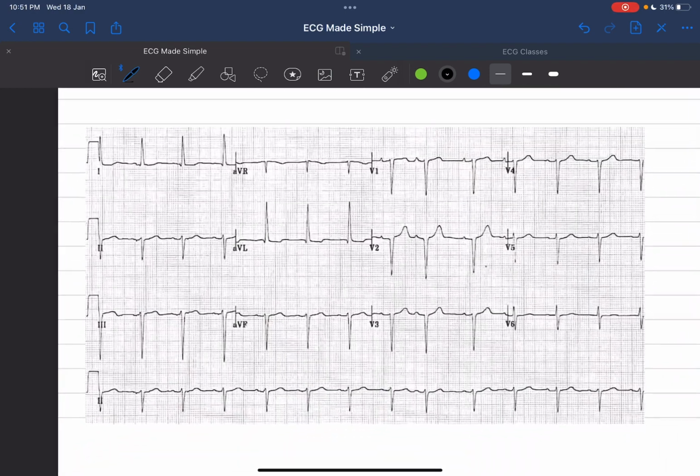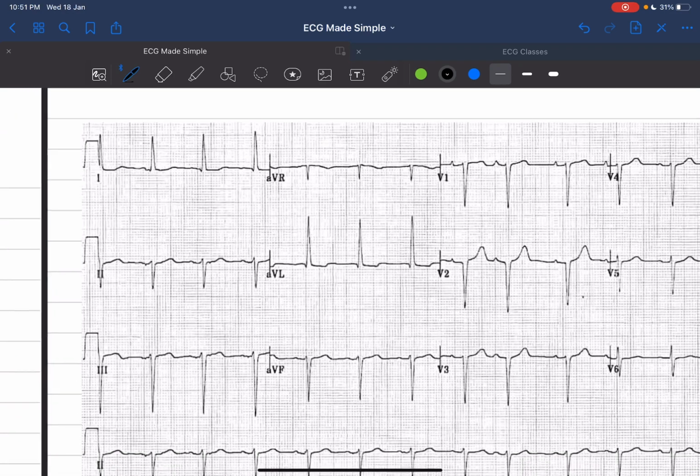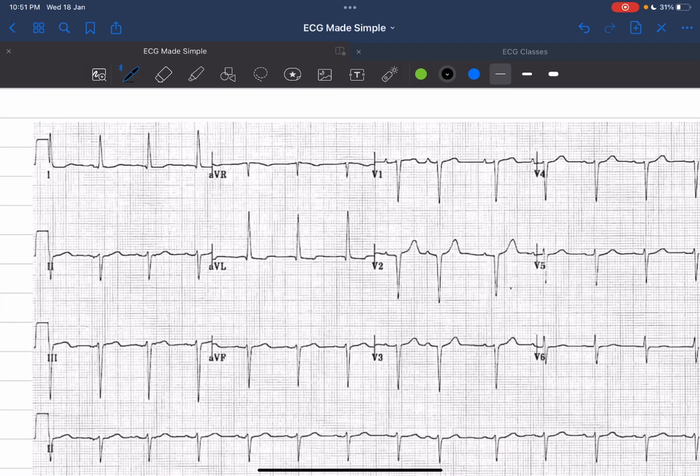This is the axis determination. Now going down, looking at the next ECG example. Just again pause the video and try to answer. If not, I will try to explain. I'm just looking into the axis. Don't look into other things. Let's not confuse the dictum. We'll go step by step.